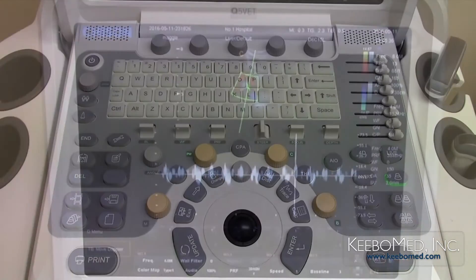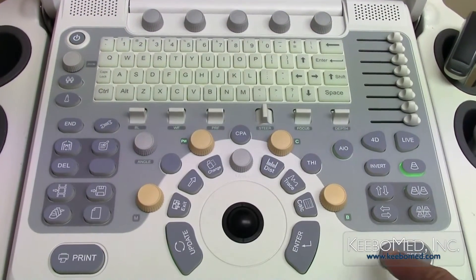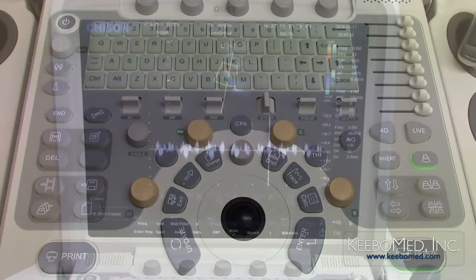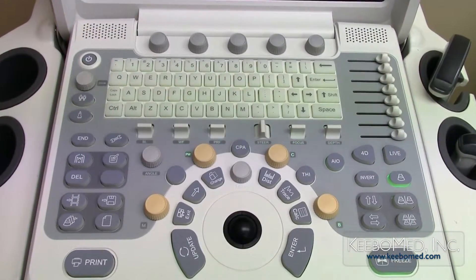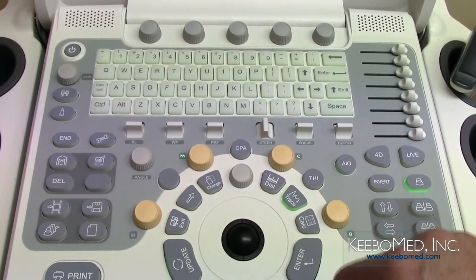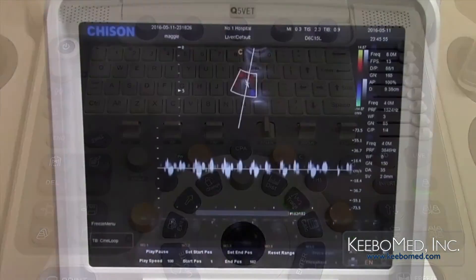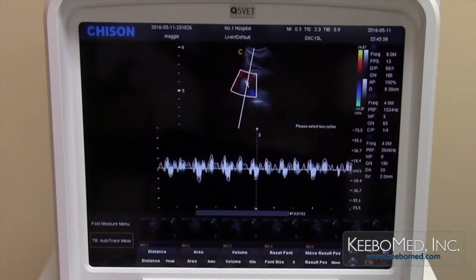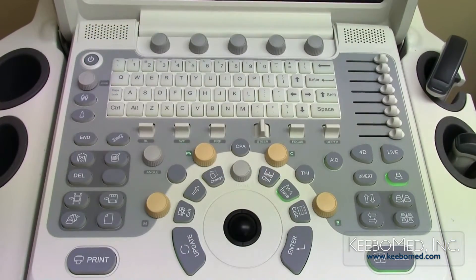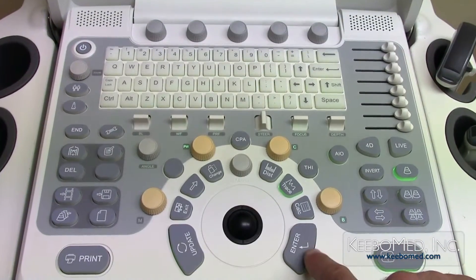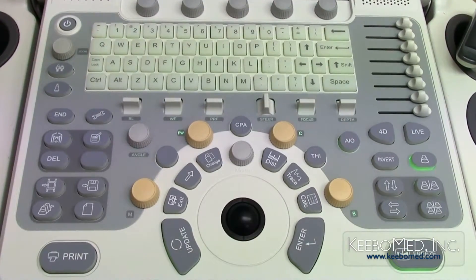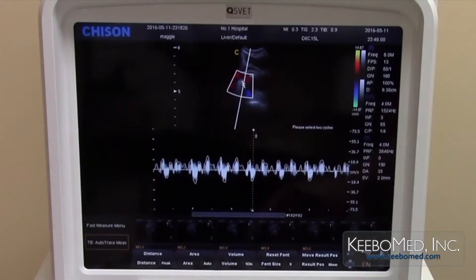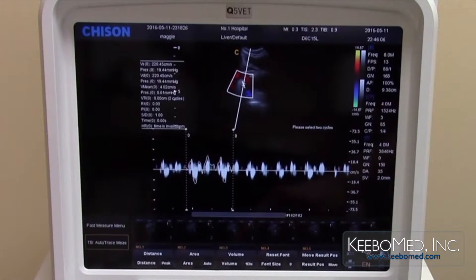Once a good spectrum is achieved, press the freeze button to freeze the image. To take measurements of the spectrum, press the trace key. To select a certain area of the spectrum to measure, move the trackball to the starting point and press enter, then move the trackball to the end point and press enter. The measurement results will be displayed on the screen.